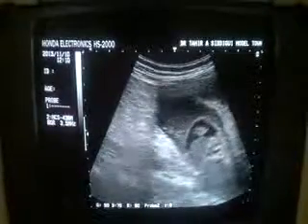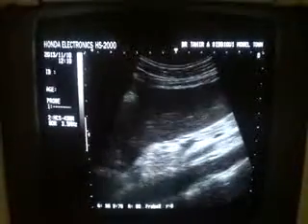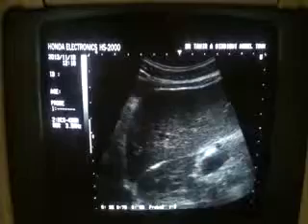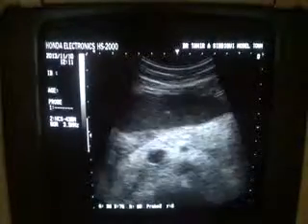I am showing you the gallbladder from different angles. Here, this is the pancreas — this white band is the pancreas — head of the pancreas, splenic vein, superior mesenteric vein, and this is the superior mesenteric artery rising from the aorta. No peripancreatic adenopathy is seen. There is no mass relating to the pancreas. The pancreatic duct is non-dilated.